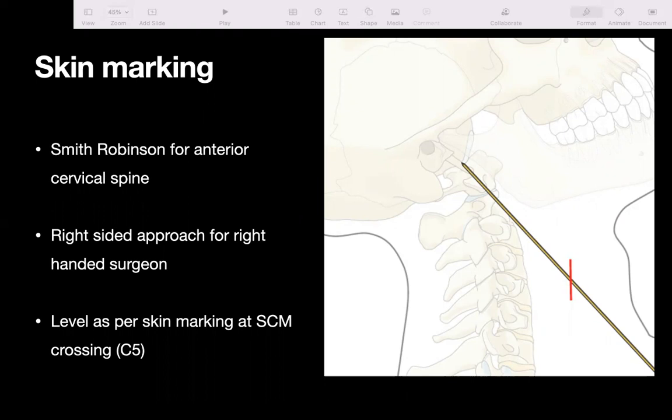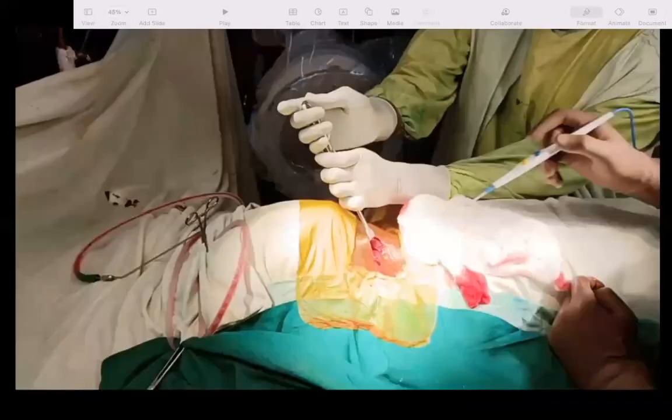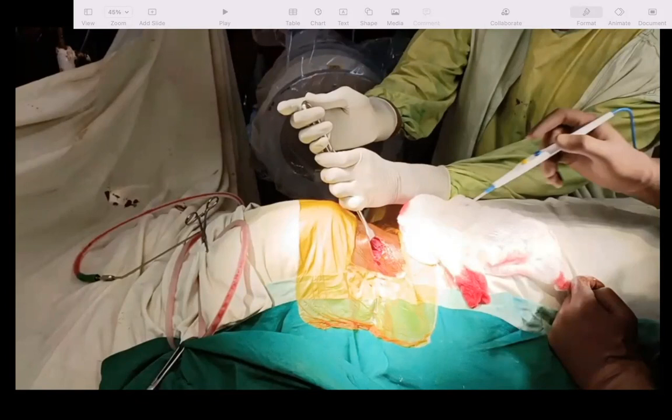On this same patient, we performed an anterior approach from the right side. I am standing at the axilla of the patient; you can see the C-arm. My assistant is standing on the opposite side. We used a Langenbeck retractor for retraction — I prefer this over a Hoffmann's retractor in this approach.